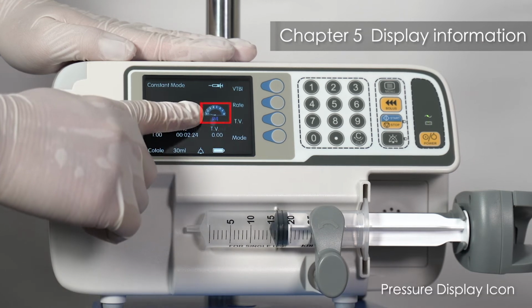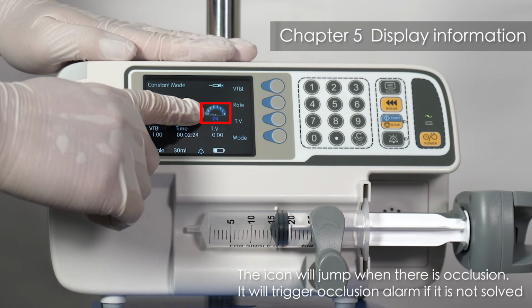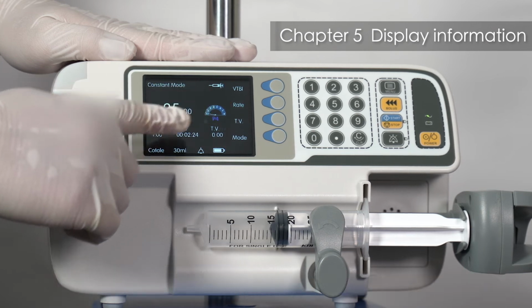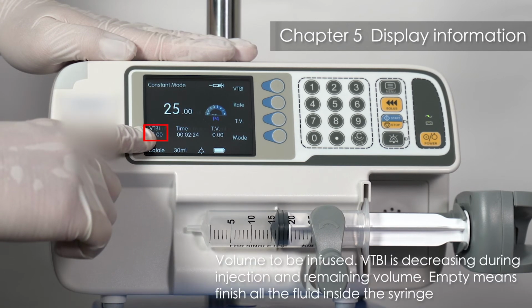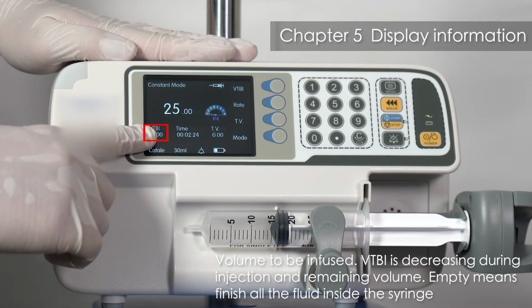Pressure display icon. The icon will jump when there is occlusion. It will trigger occlusion alarm if it is not solved. VTBI, volume to be infused. VTBI is decreasing during injection and shows remaining volume. Empty means finish all the fluid inside the syringe.